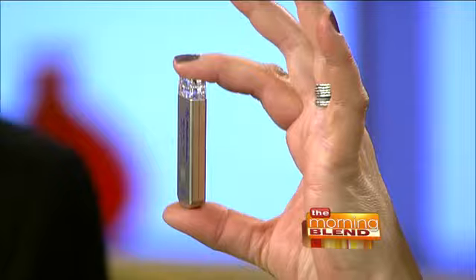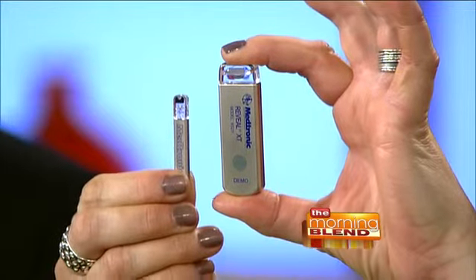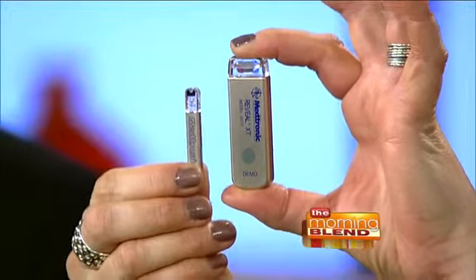I'm going to hold this up so we can see it on camera, because this is different than even a pacemaker. This is newer technology, a fairly small implantable device, right? Correct. It looks like a flash drive, and the old one is a little bit heavier. Here is the new one. It's so much smaller and lighter, and it's able to do more than the old device. It can stay in the body for up to 3 years, and these episodes are often not very frequent, so that increases the likelihood that you will find the cause. Also, this new device is capable of being monitored remotely, which is a huge advantage.